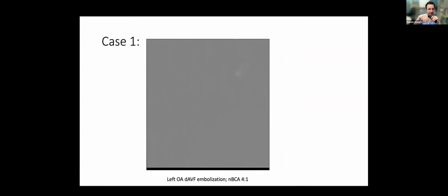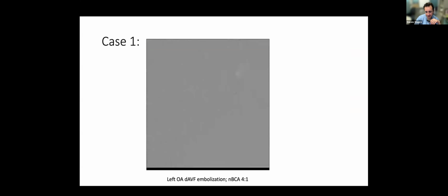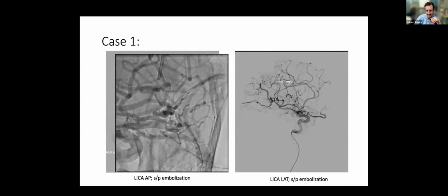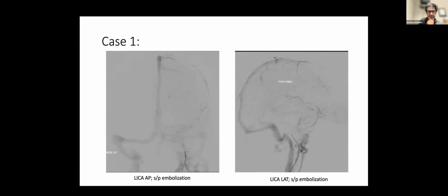I think there might have been drainage. There's still venous drainage going down into ethmoid veins, intranasal veins, up into the superior nasopharynx. If you look at the post-embo... maybe, I'm not sure, but it looked like it could be, and that's one place they can drain. You see how there's a shadow? Not post embo, post surgery.